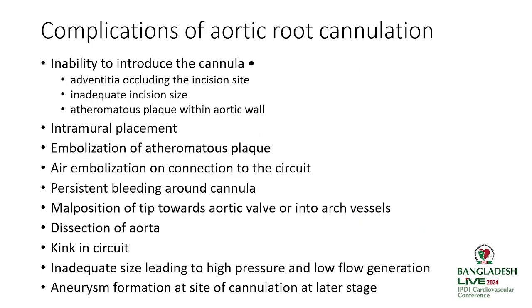Okay, so what are the complications of root cannulation? Inability to introduce the cannula. For instance, if we didn't do the adventitial clearing, there is a chance you are actually pressing the adventitia into the interior of the aorta and couldn't get the cannula into the true lumen of the aorta.